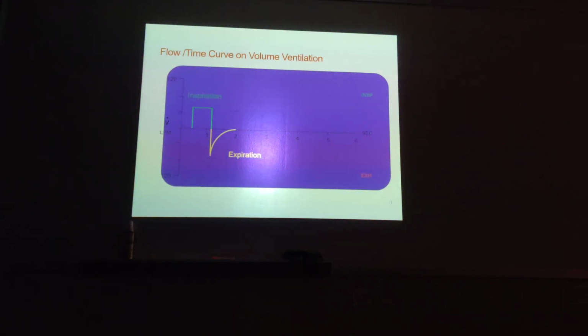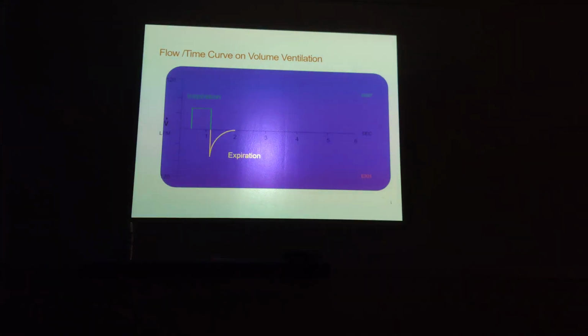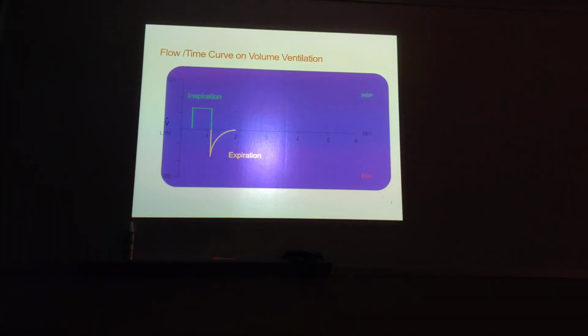Now, let me tell you this. On some ventilators like the Puritan Bennett 980, on a volume control mode, you can actually pick the type of flow that you want to use, because now they're coming up with a descending ramp. So this is the square waveform. The advantage here is that it will guarantee a constant I to E ratio for the square waveform, or square flow pattern.